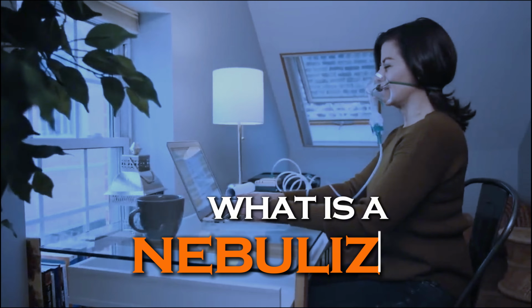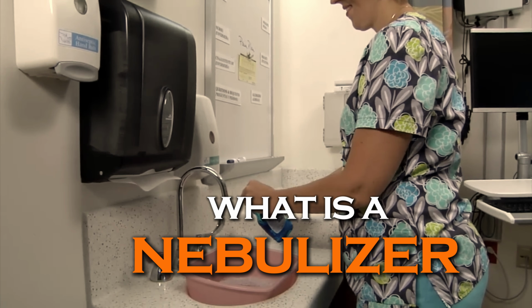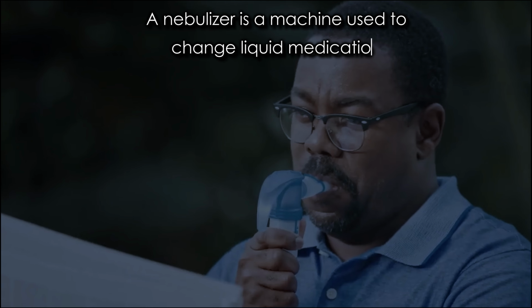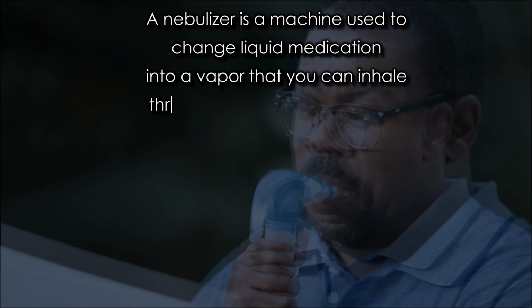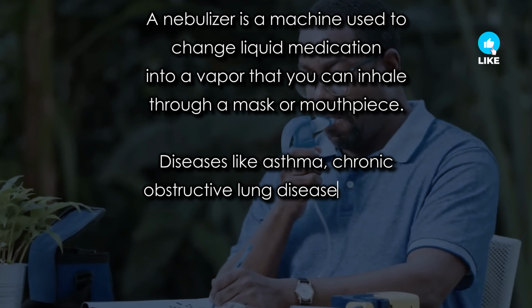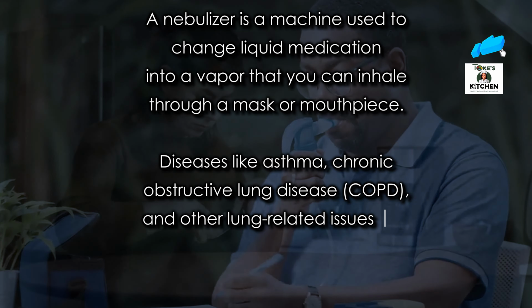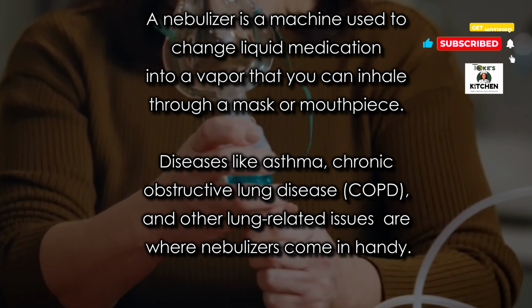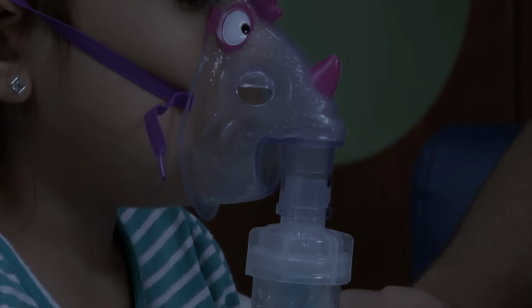What is a nebulizer? A nebulizer is a machine used to change liquid medication into a vapor that you can inhale through a mask or mouthpiece. Diseases like asthma, chronic obstructive lung disease (COPD), and other lung-related issues are where nebulizers come in handy.